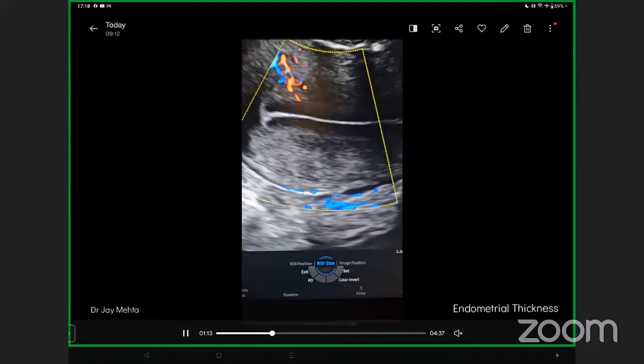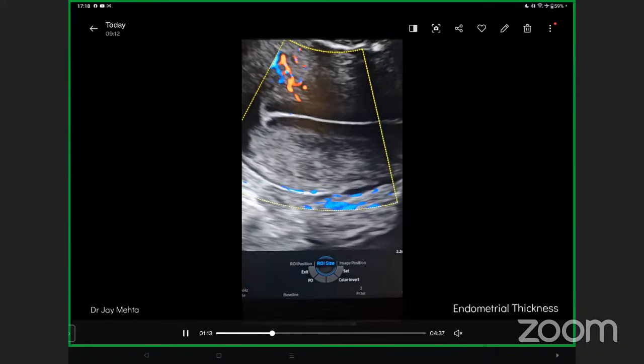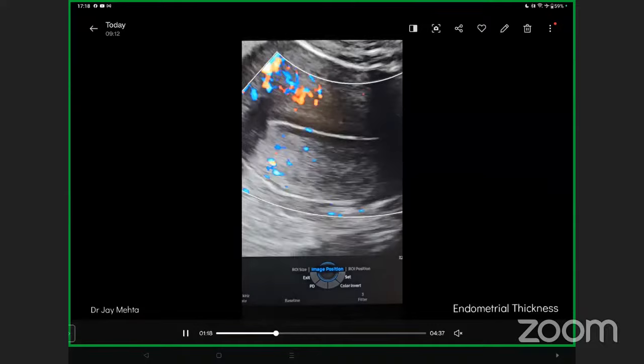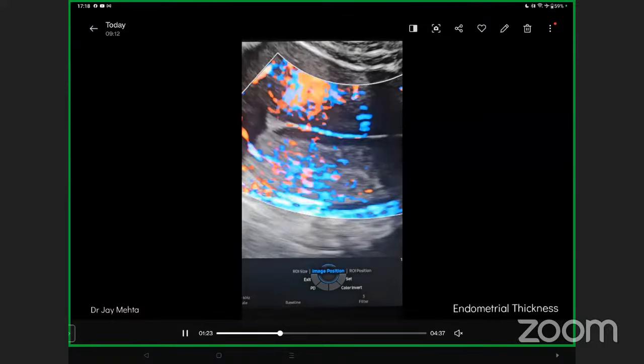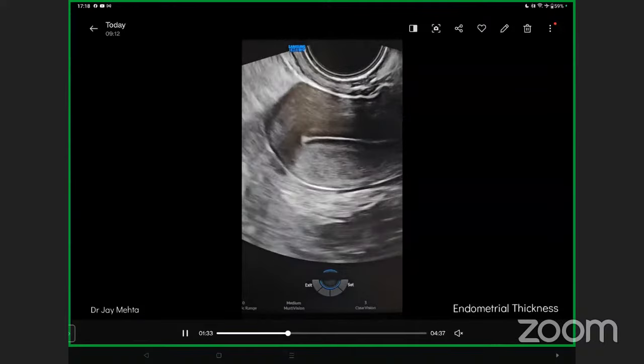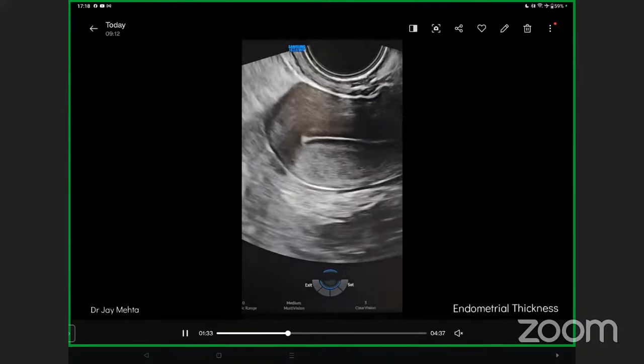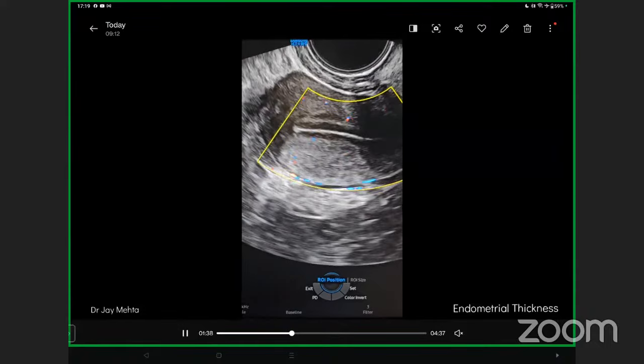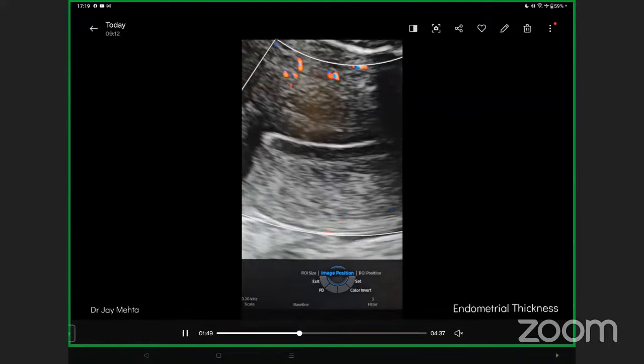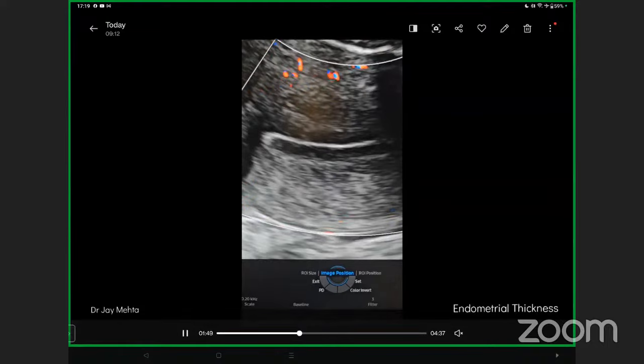Never finish the assessment at grey scale. A lot of people add a color Doppler through a window — it's always better to add a power Doppler. You can see some vascularity reaching inside the endometrium, at least reaching the basal endometrium in many places. When assessing live, we do the power Doppler assessment one to two times, and it is important that it is a zoomed-in image.